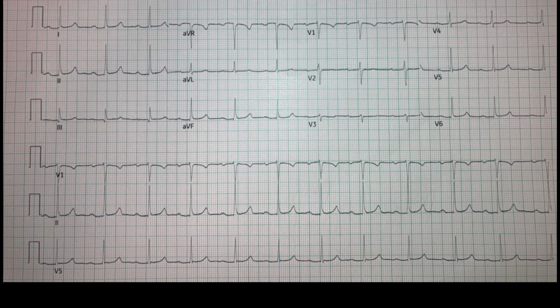And hopefully that's been enough time for you to go through it. Let's again go through this in a systematic way so that we don't miss anything. Start off with rate. When we calculate rate, as I've told you before, my favorite way to do it is to look at the total 10 second EKG. So how many QRS complexes in 10 seconds? How many beats in 10 seconds?